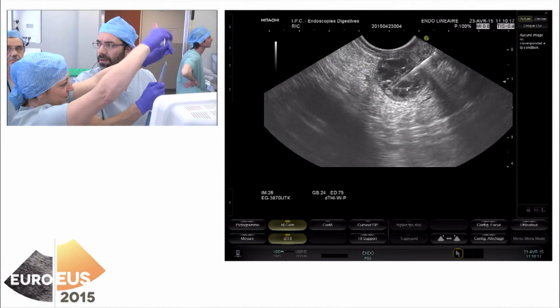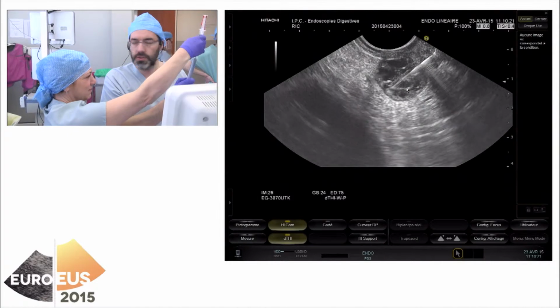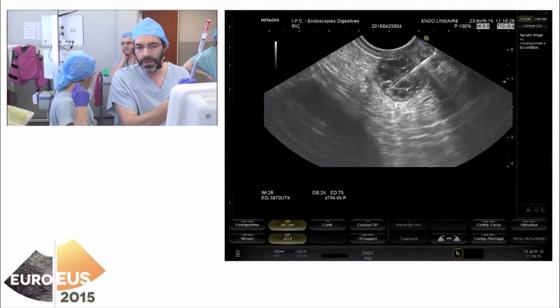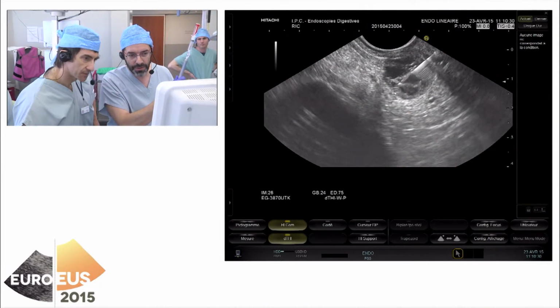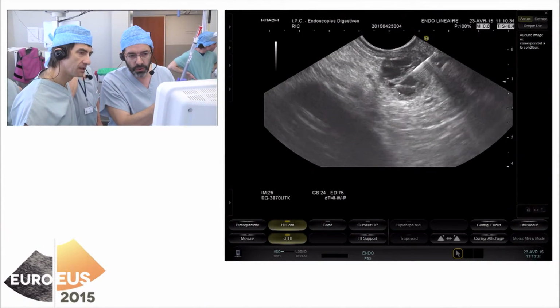Do you standardly use the suction, the syringe to suck this? I usually use it always. Always suction. And in these cases even more, because you want to take everything. Yes, because I'm mainly focusing on accessing this enlarged part of the wall. I like to do it very smoothly.